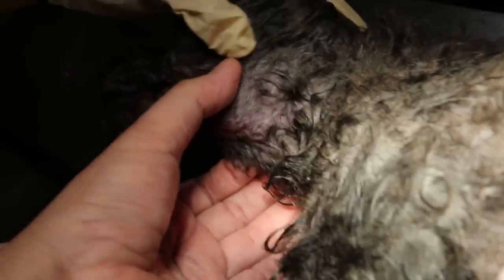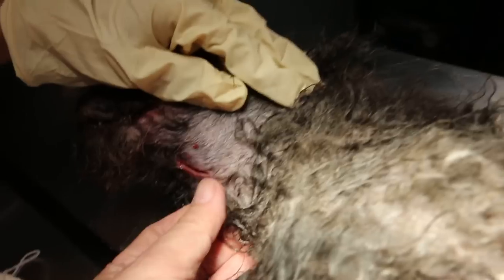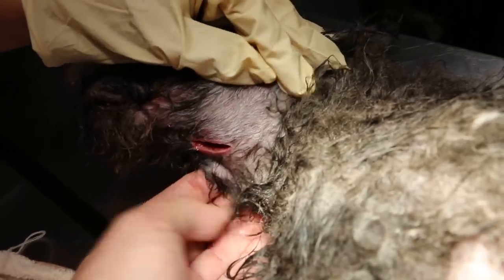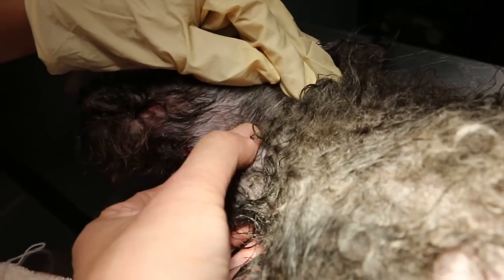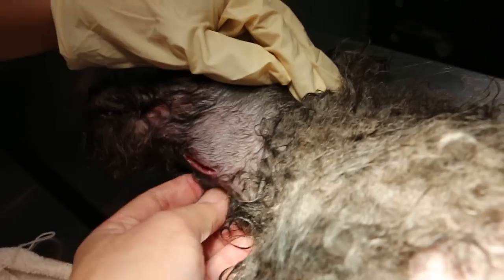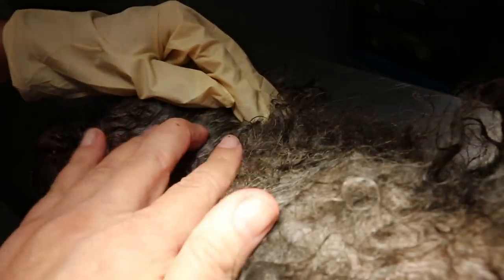Now, the initial diagnosis would be to take a syringe and aspirate, which my assistant did, and found that it was reddish-brown pus. And so the next step would be to incise. It looks terrible, but it will heal by granulation. And now you can see this dog is really at peace. It's not panting or crying due to pain.